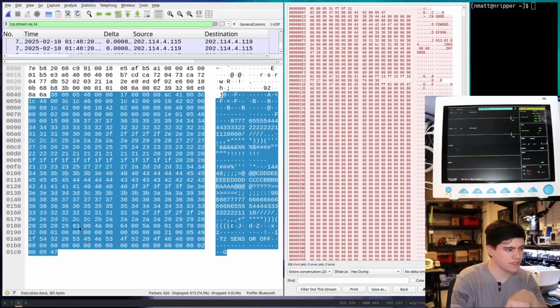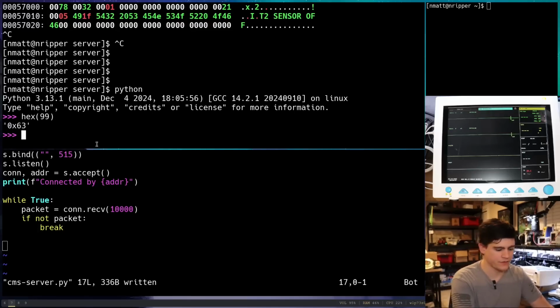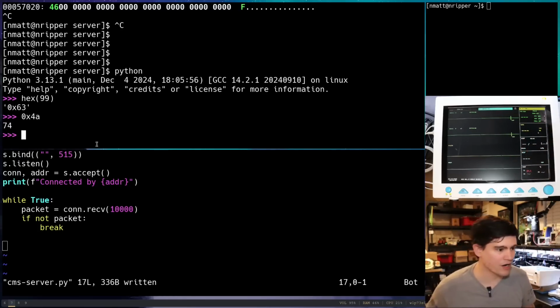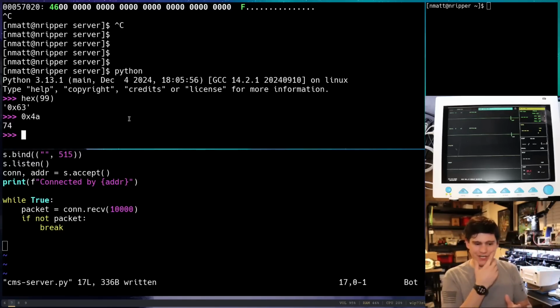Aha! So right down here, we see a 63 byte. Now, obviously, we'd have to narrow down some false positives, but here I see 63, and then I see a 0, and then I see a 4A, and a 0. Well, that's interesting. What is 4A? So let's do that the other way. What's that as an integer? 74, and I think that's what we saw at one point up here for my, not my pulse ox, my beats per minute. So my pulse. And so those are starting to look like those binary values.